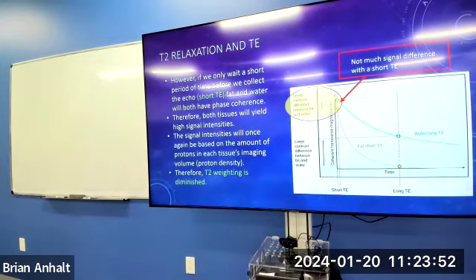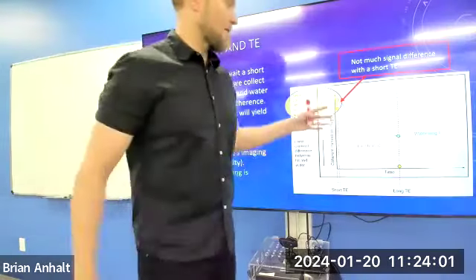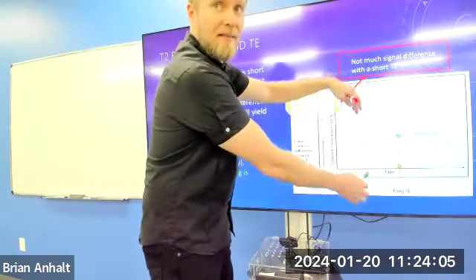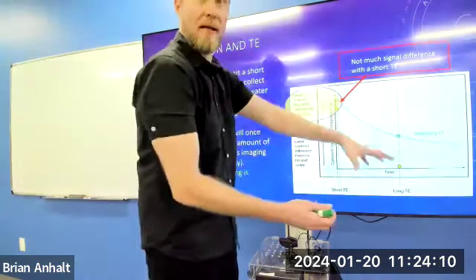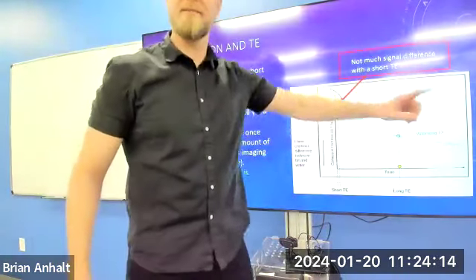Yes. That's the long TE. The second line, is that when you would do the 180 flip? No, so just imagine the 180-degree flip happening at half of that time. It's happening back here, right? It's just not showing it because in actuality, this signal decays really quick, comes back, right?